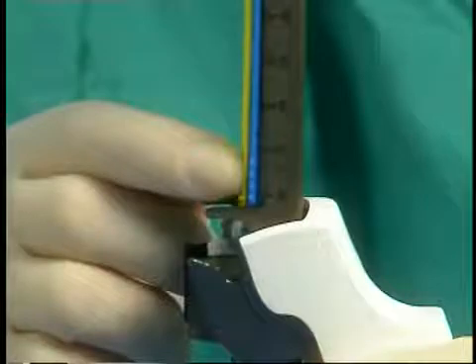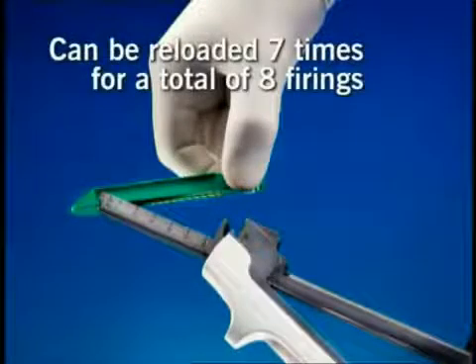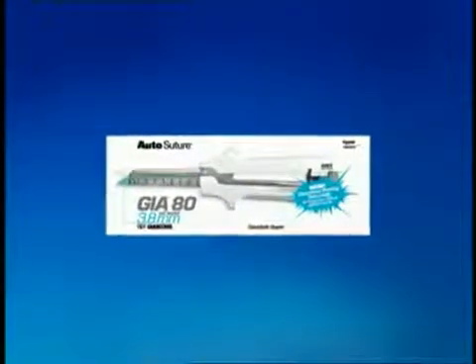Remove the yellow shipping tab. Note that the SULU is designed to float in the cartridge housing — this is a safety feature that prevents accidental pre-firing. The DST series GIA staplers are designed to be reloaded seven times, for a total of eight firings.